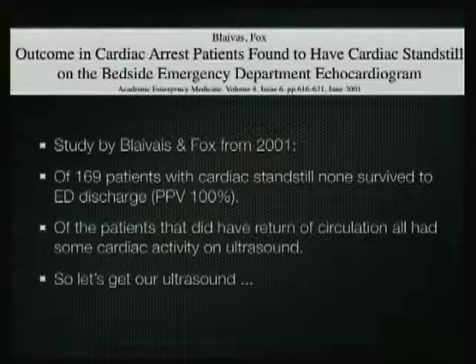And that might sound like a no-brainer, but it's actually very clinically important to realize that you can do an ultrasound, and if you see cardiac standstill, that suggests that the patient's not going to recover, and you can abort your therapy and ACLS and triage your resources to the other patients that actually have a chance of survival. Of the patients that did have return to circulation, all had some cardiac activity on ultrasound. So this is an interesting finding. It's only one study, but there is a multi-center study going on currently to help see if this pans out.